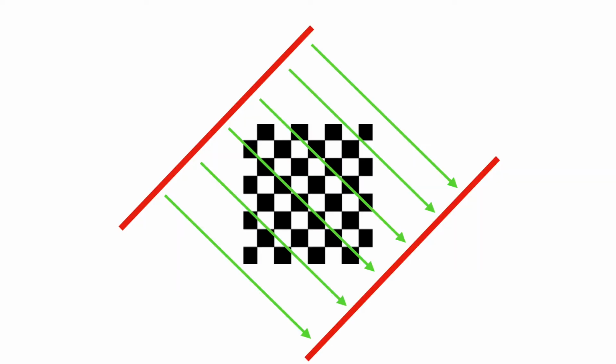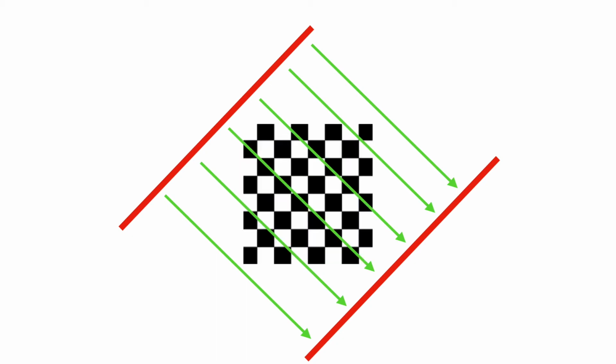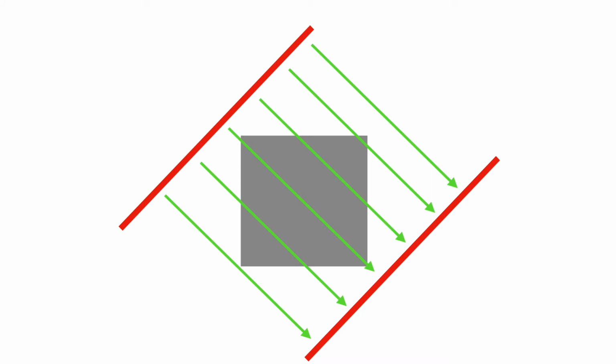Why is this difficult? As a thought experiment, consider for now a checkerboard that we're trying to measure with computed tomography. And let's compare this with a plain gray square that we're also trying to measure. As you can imagine, no matter which direction we take our measurements from, we will produce a fairly similar result, no matter if we image the square or the checkerboard. This makes it very hard to distinguish those two using computed tomography and makes reconstruction difficult.